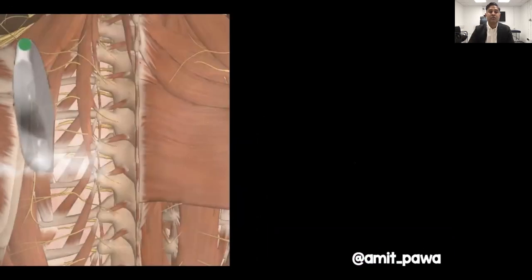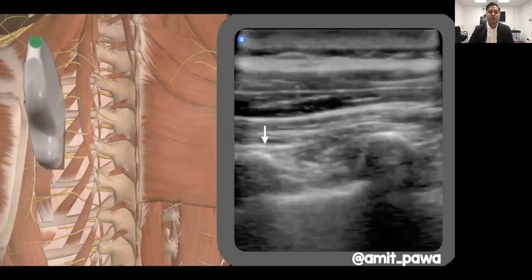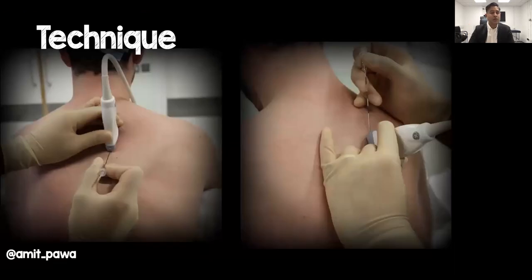Starting with the probe laterally over the ribs, you see the curved dropout shadow of the ribs. As you slide towards the midline, the ribs transform into transverse processes. As you get closer to the midline, the erector spinae muscle becomes thicker — appearing out of nowhere — and you get the square or rectangular shape of the transverse processes with the overlying fascia. That's when you know you're in the right place.